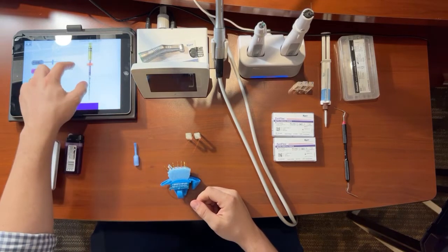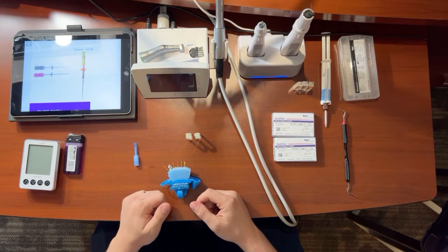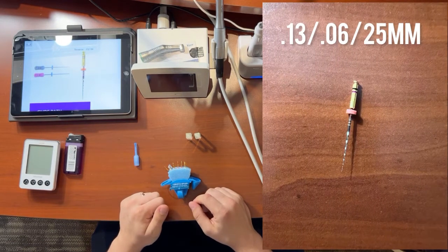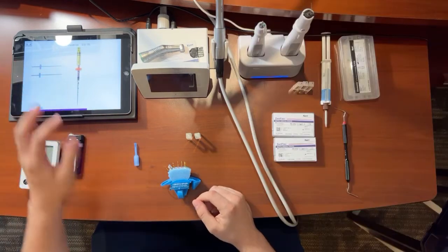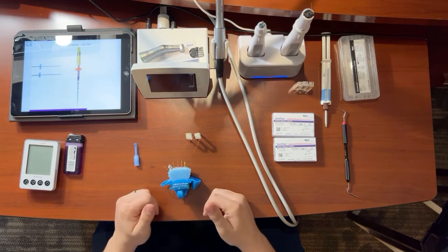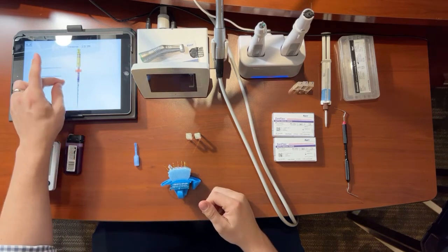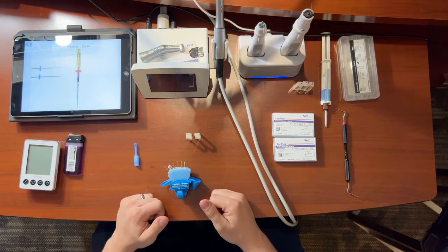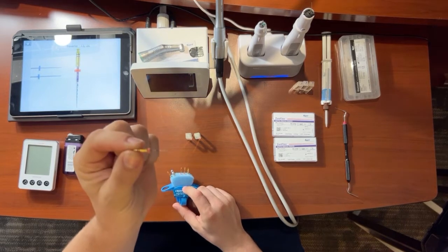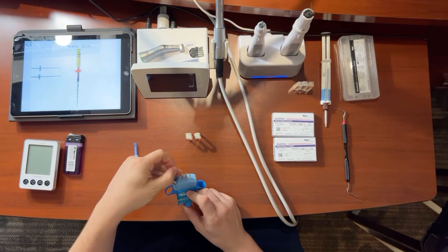Next you'll move into your 1306 or 1806 glide path file, depending on whether the canal is super tight or super large, but typically I recommend going with this 1306 Traverse glide path file. It looks like this right here, and I'll walk you through all these steps in just a moment live.